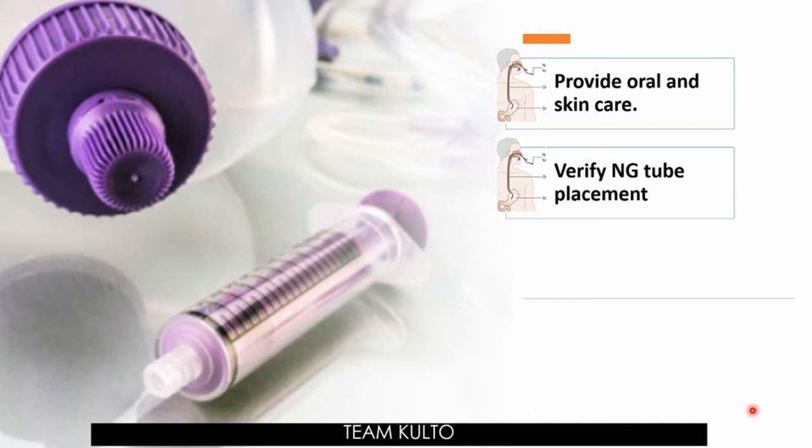Always verify that the NG tube is in the stomach by aspirating a small amount of stomach contents. An x-ray study is the best way to verify placement. Again, anong confirmatory na NG tube placement mo? X-ray. Now, you always need to wear gloves.